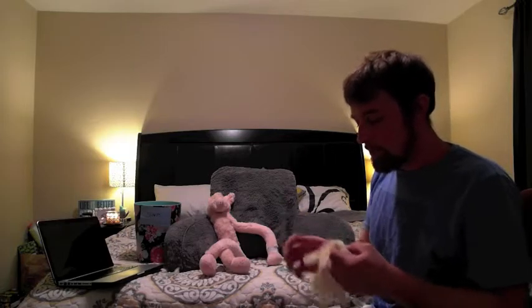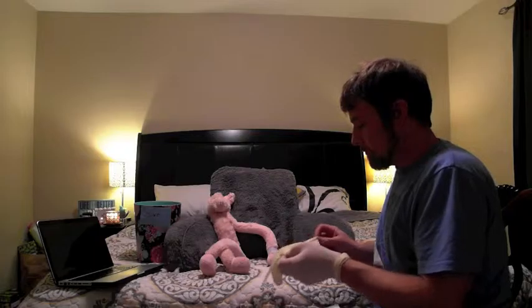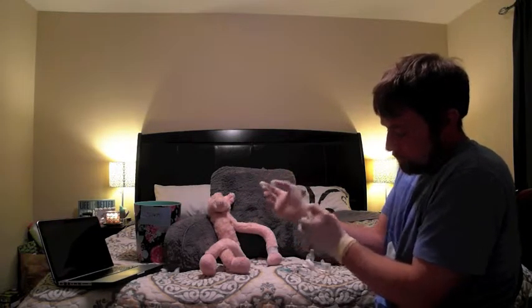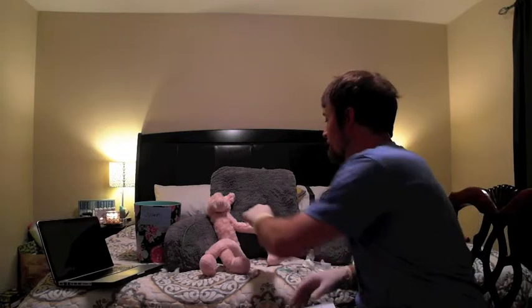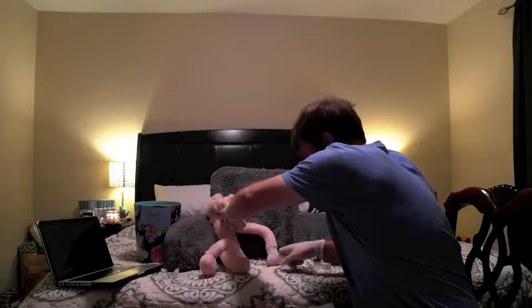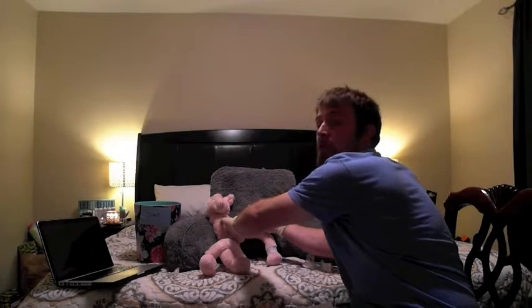Next I'm going to get my gloves. I'm going to palpate the area to find the landmarks again. Find my acromion process, 3 fingers down. Pull the skin taut. Push in the needle.